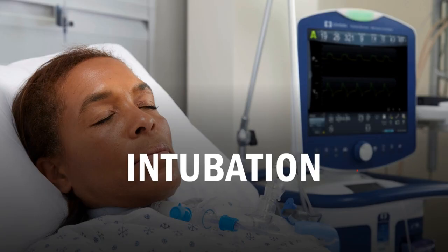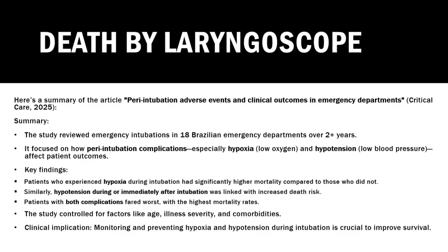When we intubate someone, we take that negative pressure system that our bodies are used to and we completely reverse it. Now we are no longer negative pressure breathing, but we are now positive pressure breathing. We are forcing air into their lungs with pressure. And this is a big responsibility that we take on for these patients. We are fully taking away their ability to breathe for themselves, and with that comes a higher chance of mortality and a lower chance of getting to leave the hospital.